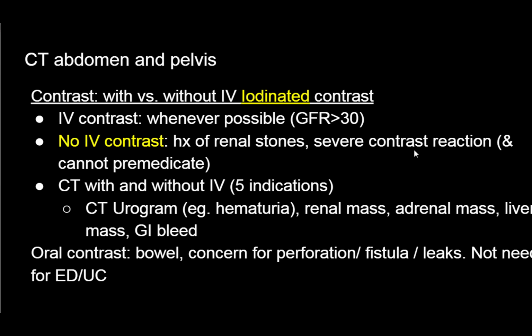Also, patients with severe contrast allergy who cannot be premedicated, for example, because they're unstable and they need stat CT abdomen and pelvis, should not get IV contrast. So in patients who cannot get IV contrast, we typically want at least oral contrast to be given.